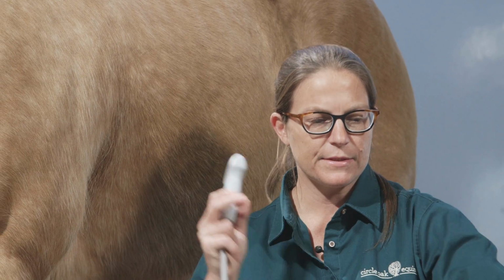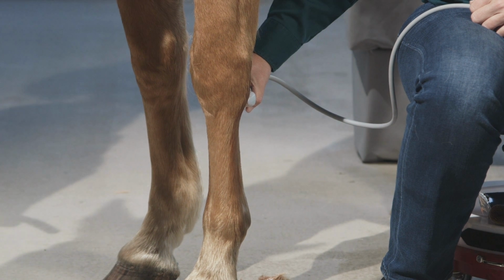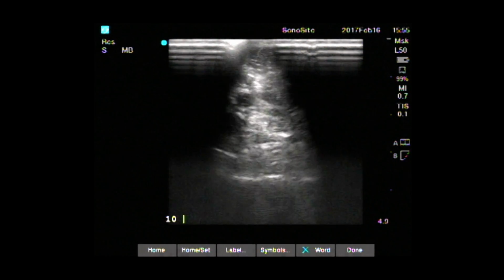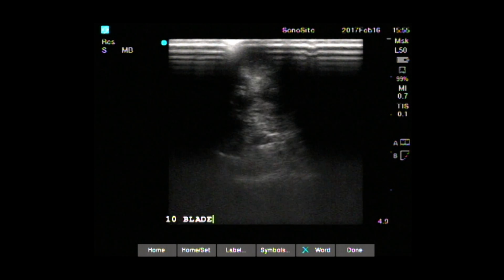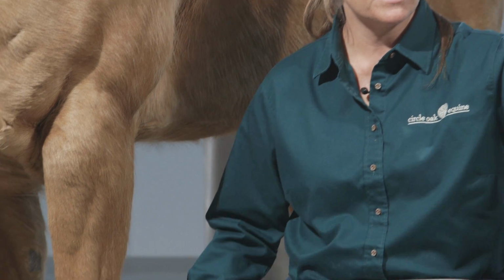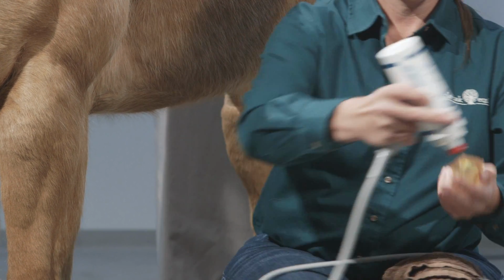And then some of these guys I do scan with a standoff, some I scan without. It just depends on the actual image quality. So I'll go ahead at this point and put my probe on the leg and see what level of image quality I'll get. I'll adjust my depth and my gain. I do like to label that it's only been clipped with a 10 blade, just like I would label it if it was unclipped. And then again, I will check it at that situation with the alcohol as well. And so again, in this situation, I may go ahead and just put the standoff on and see if that improves my image quality at all.